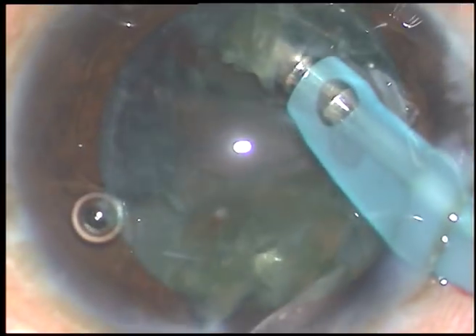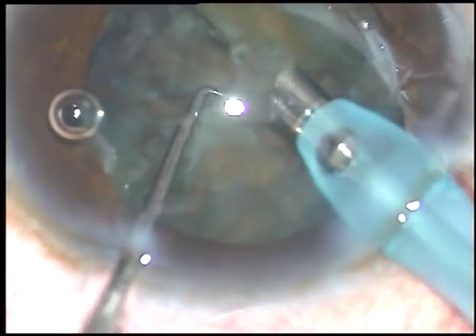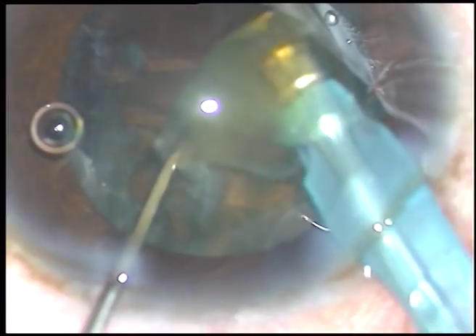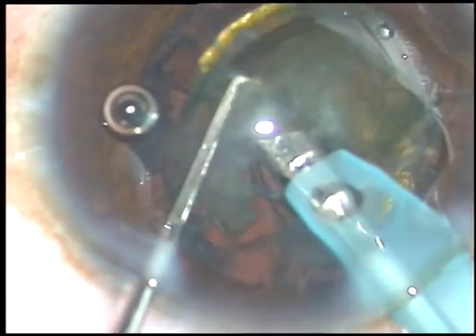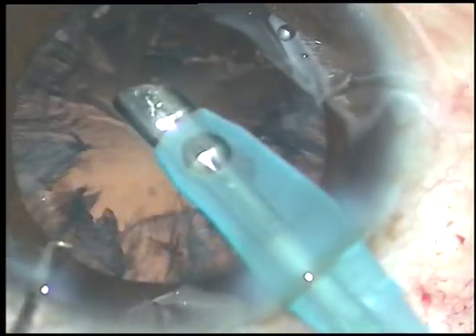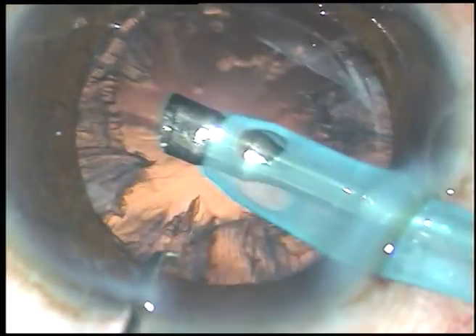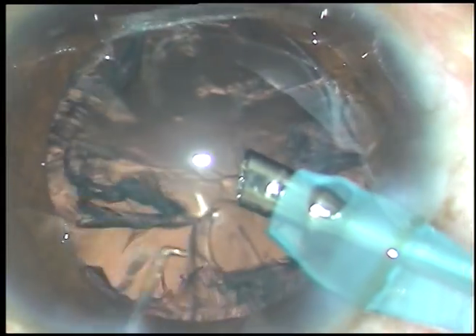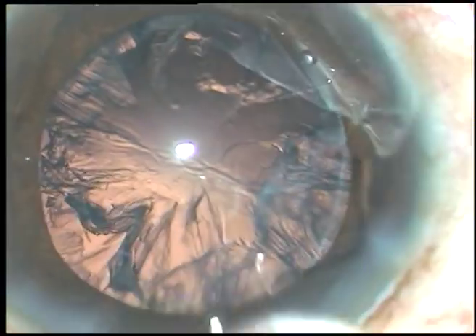Now I remove this portion, and this is the other portion. In the lens tilt technique, the posterior capsule is totally safe and your phaco probe should be at the iris plane, though one equator will be in the supracapsular area.